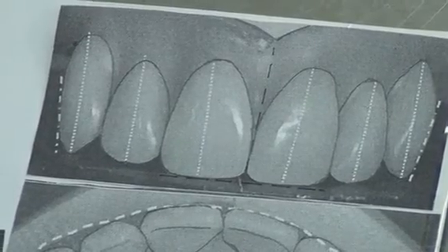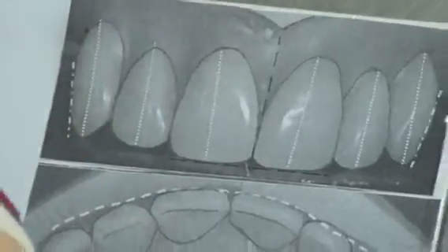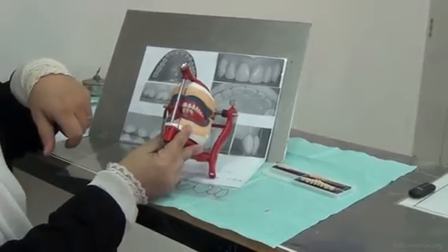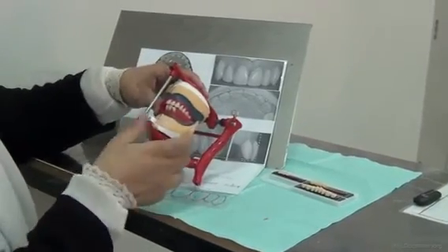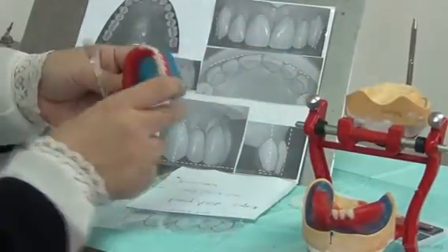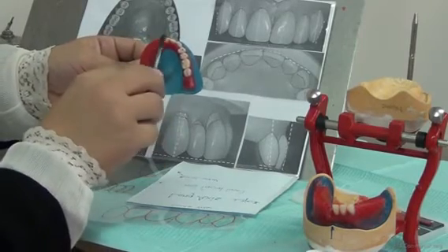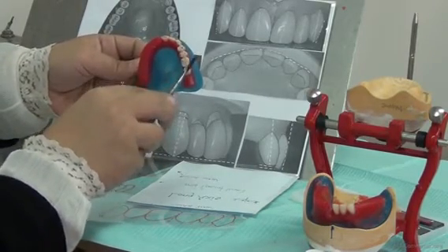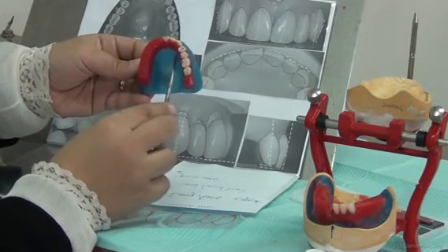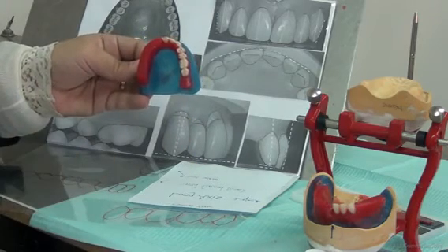So let's revise the work. First, let's go through all points. We first judge the work on the articulator: the pen is touching, the occlusal plane is flat, and the wax are touching each other. And on the other side, we have the midlines coinciding. Then we take the upper out. We judge the external arch lines. We take an occlusal view, judge the external outlines, the arch, the mid buccal, and the posterior buccal lines. We compare the palatal line. We compare the cusp line, the palatal cusp line with the lower. We compare the incisive line. So we have multiple lines to compare occlusally.